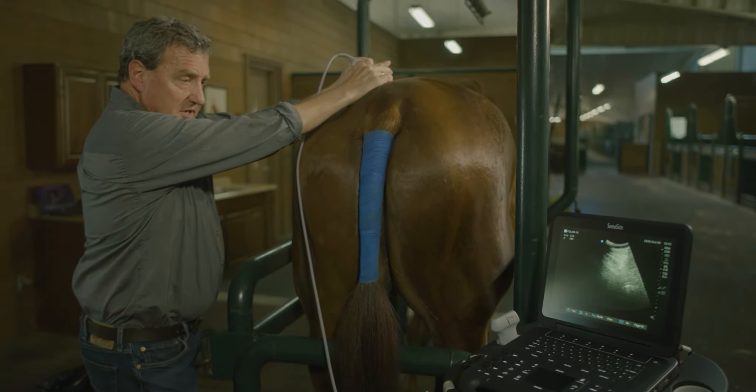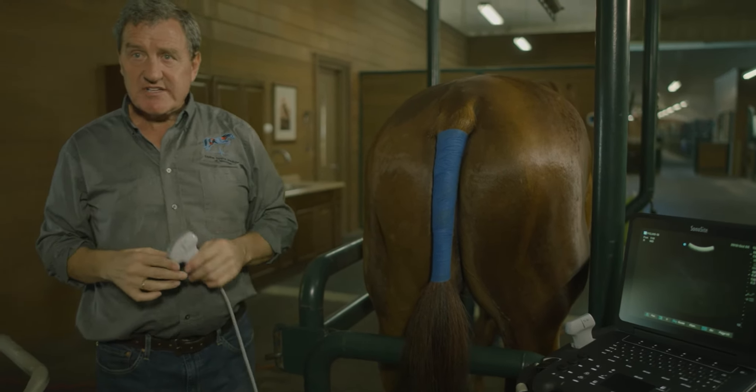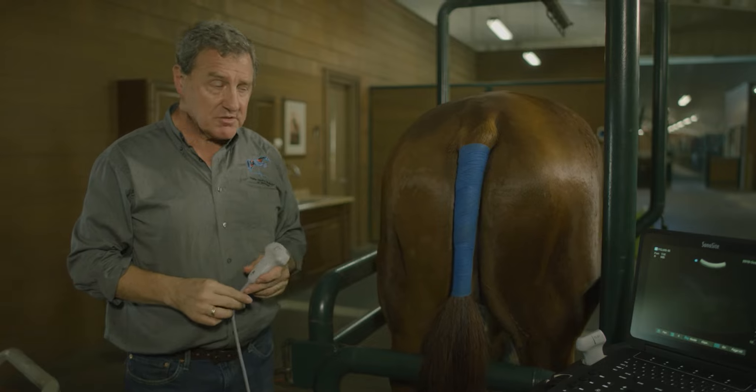That's your full evaluation of external and transrectal ultrasound of the pelvis in the horse.